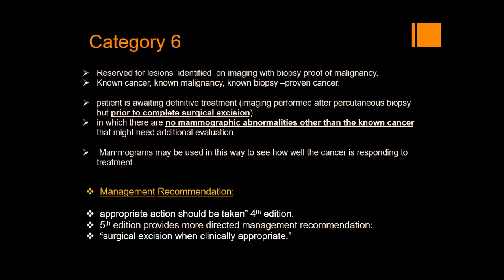Category 6 is reserved for lesions identified on imaging with biopsy-proven malignancy. Any biopsy-proven cancer will be category 6.